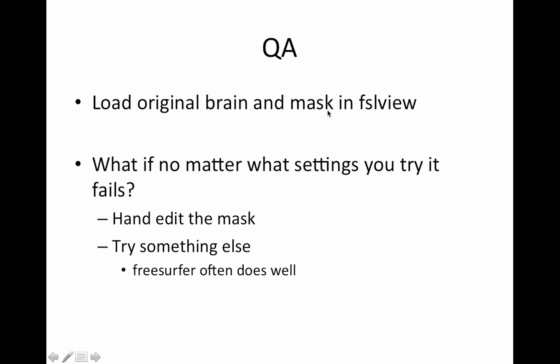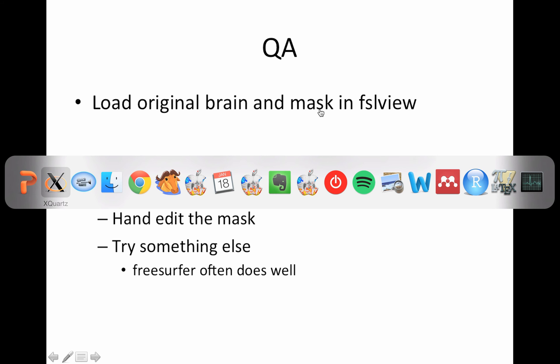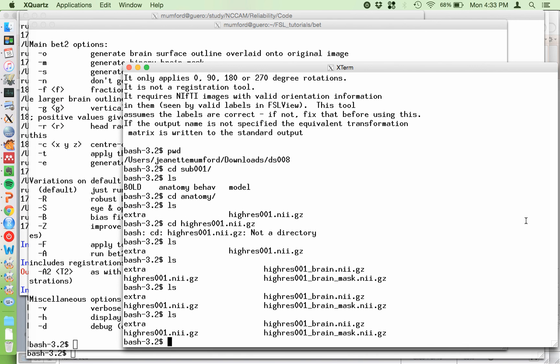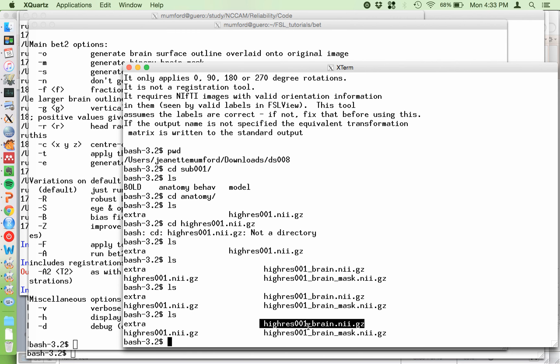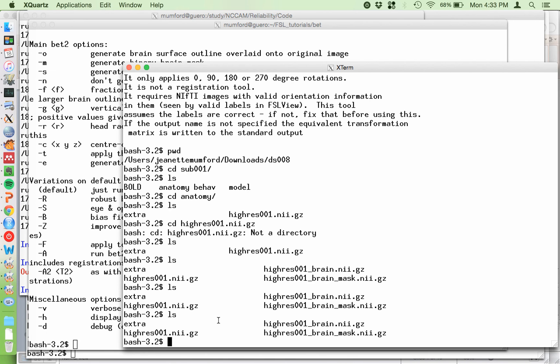For the QA step, you're going to load the original brain and the mask created in FSLview. After you run the script, your directory will have a high-res image, a high-res brain mask, and the high-res brain. The underscore_brain file is the actual skull-stripped brain, and the mask file is just a binary mask. Remember, the naming convention requires the only difference between your image with and without brain to be underscore_brain — that'll be handy later when we use FNIRT.